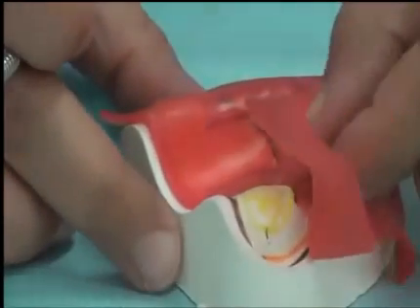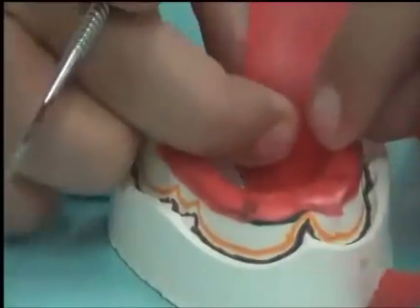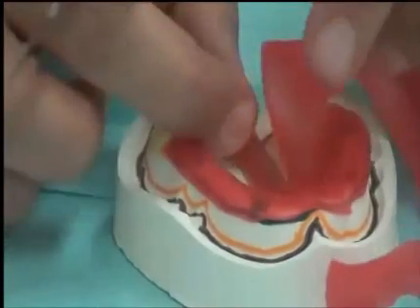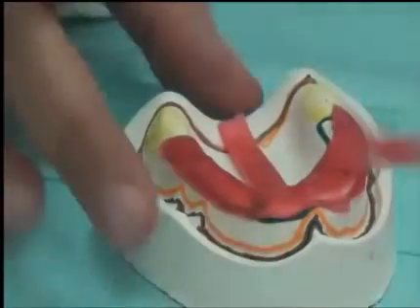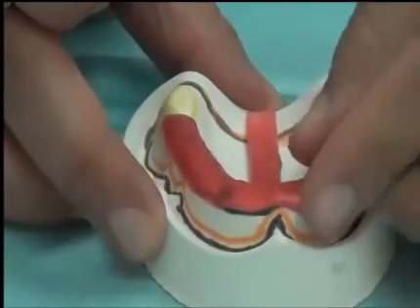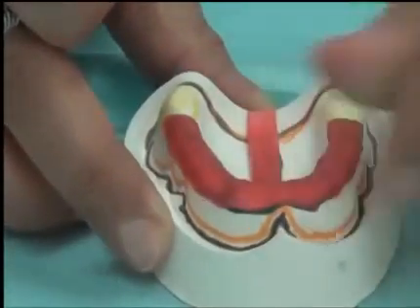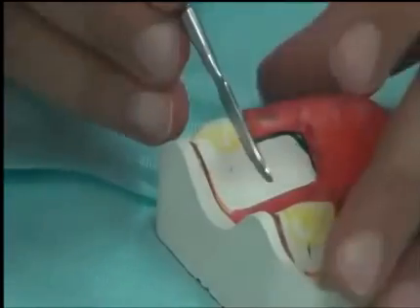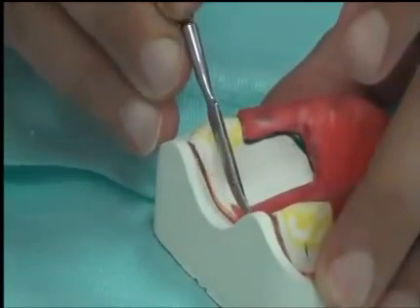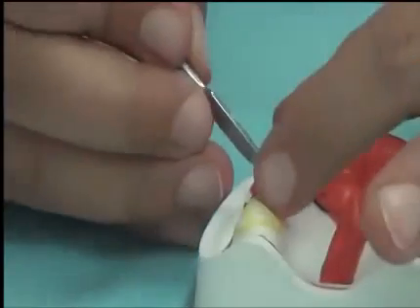You notice that the wax is still warm, so after I remove the excess, I could still adapt the material even better to the borders that I have used. A bit short from the border area, just a bit short. Then I'm opening the boxes.